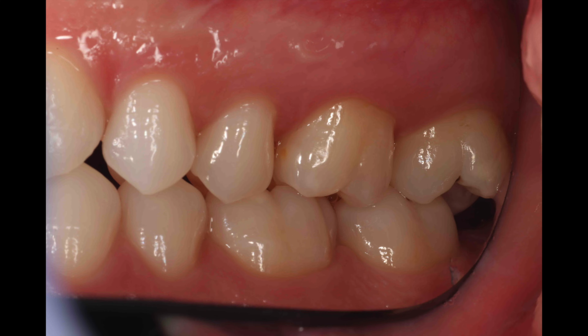A common problem with the buccal shots is incorrect zoom and mirror placement. Here, the photographer should have slanted the mirror downwards and moved in slightly so that the edges of the mirror were not visible. The ideal photograph captures the distal of the canine to the distal of the last tooth. Also, the assistant's glove is visible in this image. She cannot see what you see, so always remember to direct.